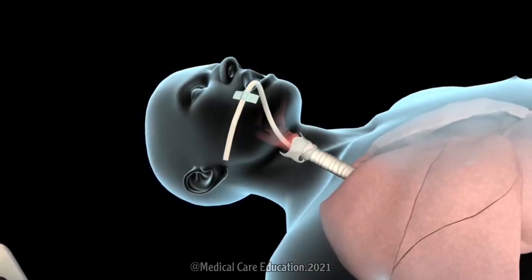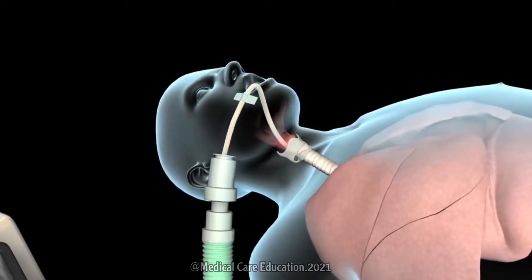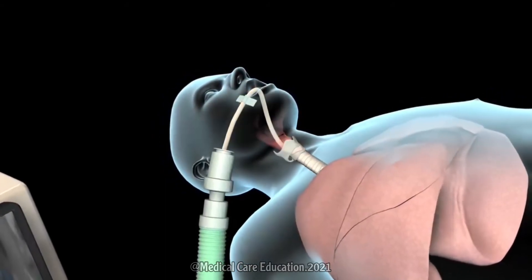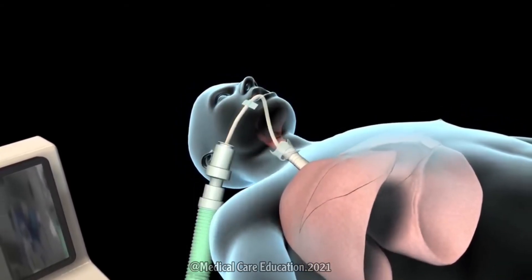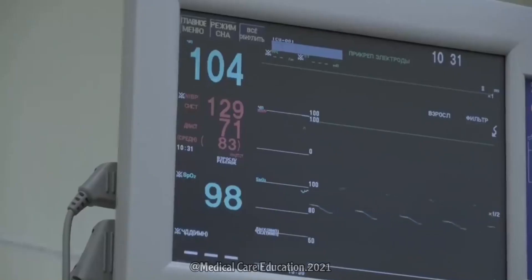Once the endotracheal tube is in the proper position, your doctor will attach it to the mechanical ventilator, which will have a specially designed pump that aids respiration by delivering well-oxygenated air into the lungs and permitting carbon dioxide to escape. Levels of oxygen and carbon dioxide will be closely monitored to confirm that the ventilator is working properly.